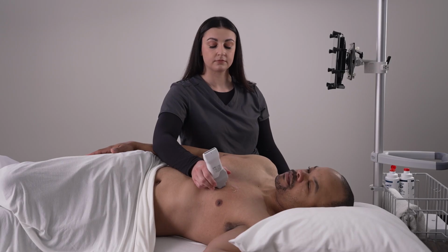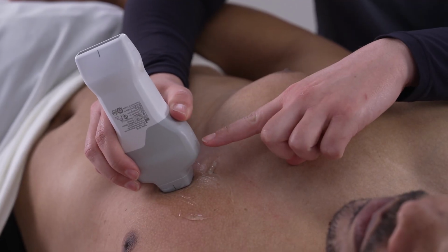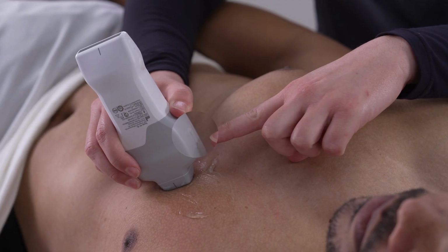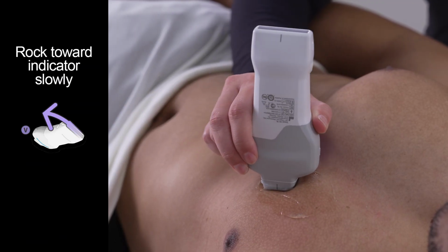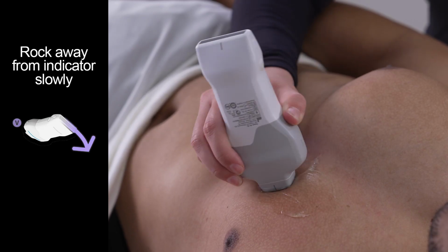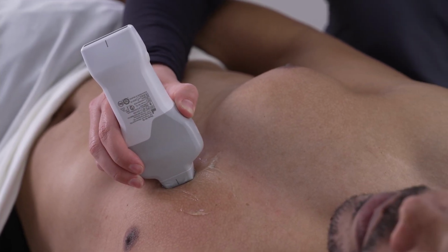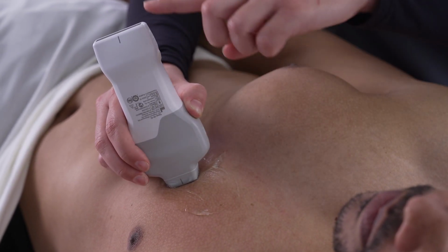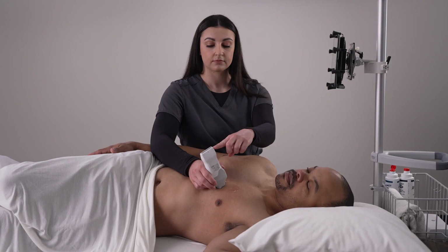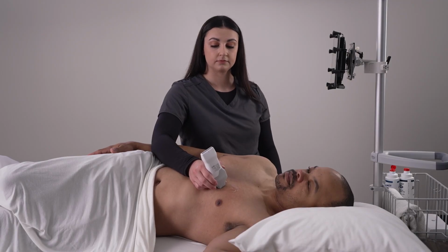Rocking and tailing are both angling movements and are performed along different axes of the probe. Rocking refers to movements performed along the indicator axis. Since the indicator is only on one side of the probe, the directions for rocking will be to rock towards the indicator or to rock away from the indicator. Tailing is the second angling movement that is performed along the non-indicator axis. The tail also refers to the end of the probe. You can make tailing movements in 4 different directions, depending on the view you are trying to acquire.